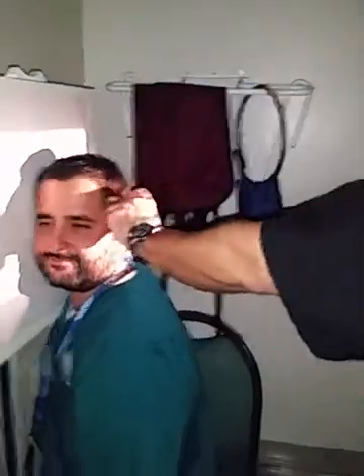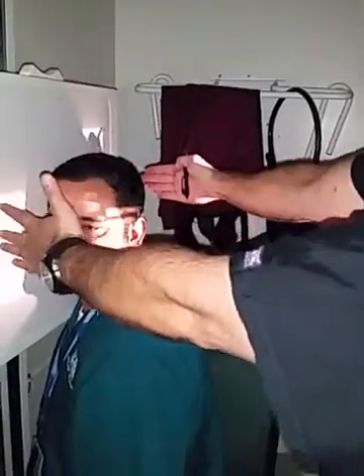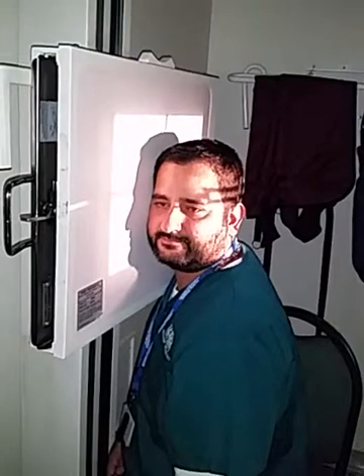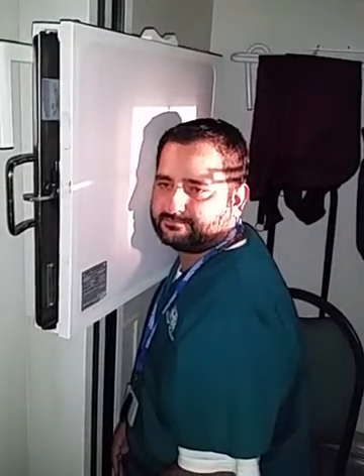So, the book says 2 inches above your EAM. So, we're going to test this theory. Now, again, you'd have to turn your cassette crosswise, right? Because the skull is going to be longer than it is tall. So, you want to turn it to that transverse position. And then we can start collimating and see where we are. If you clip off the tip of his nose, doesn't matter, right?